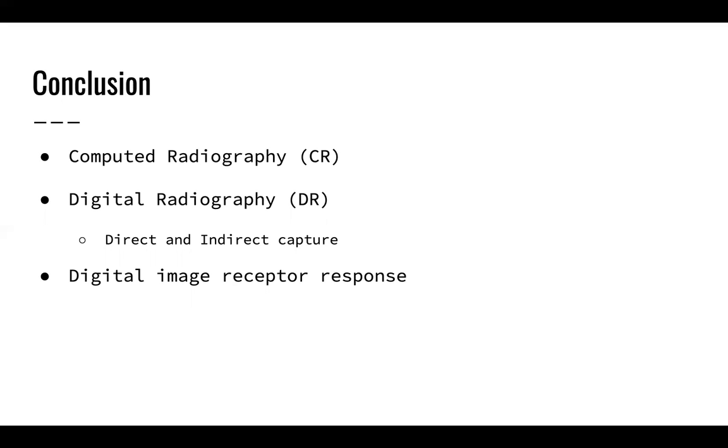And then finally, the digital image receptor response is how the image receptor responds to the radiation. And with that, we compared film and digital.